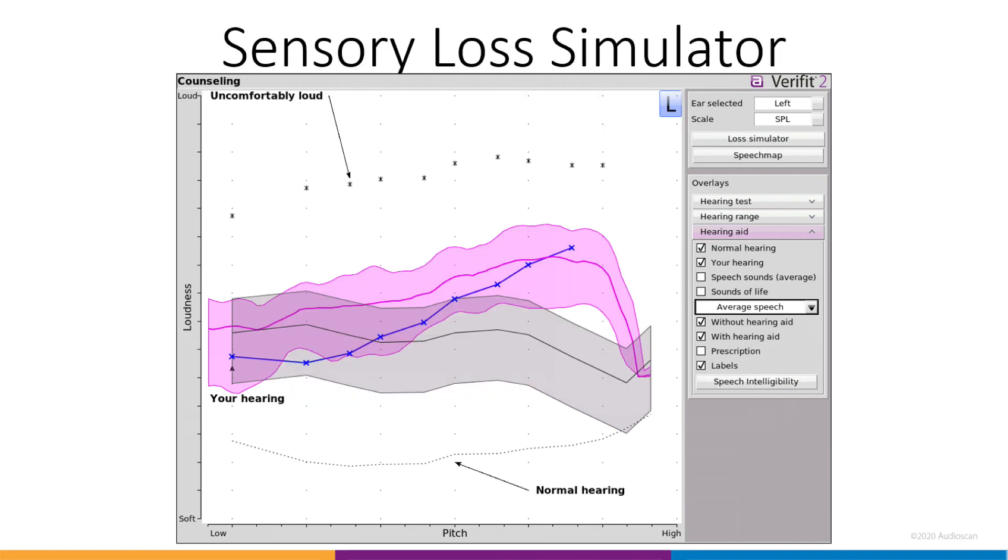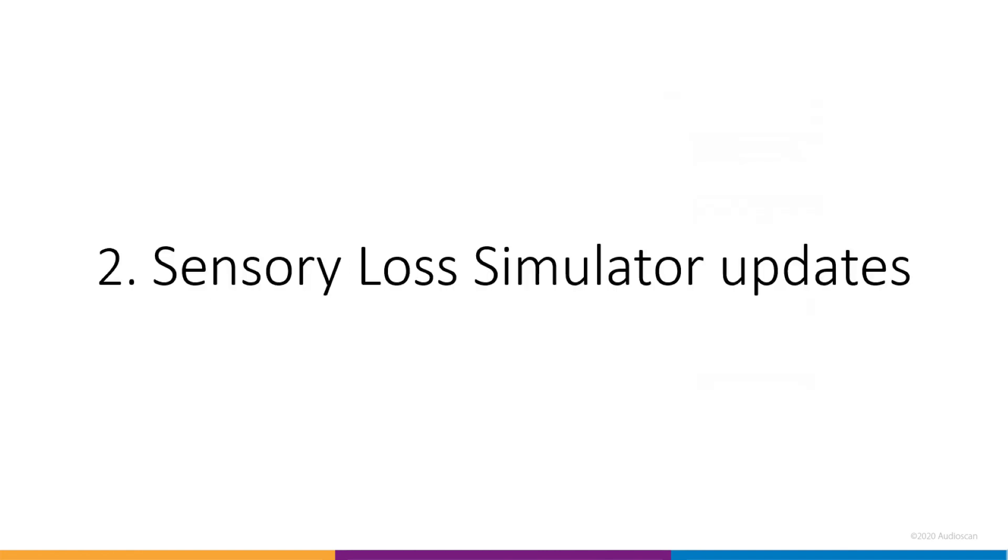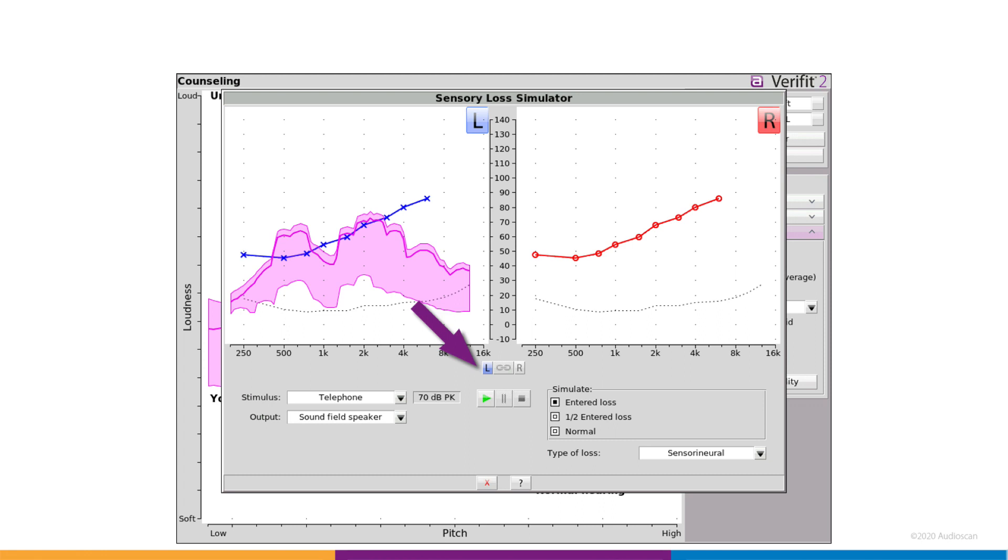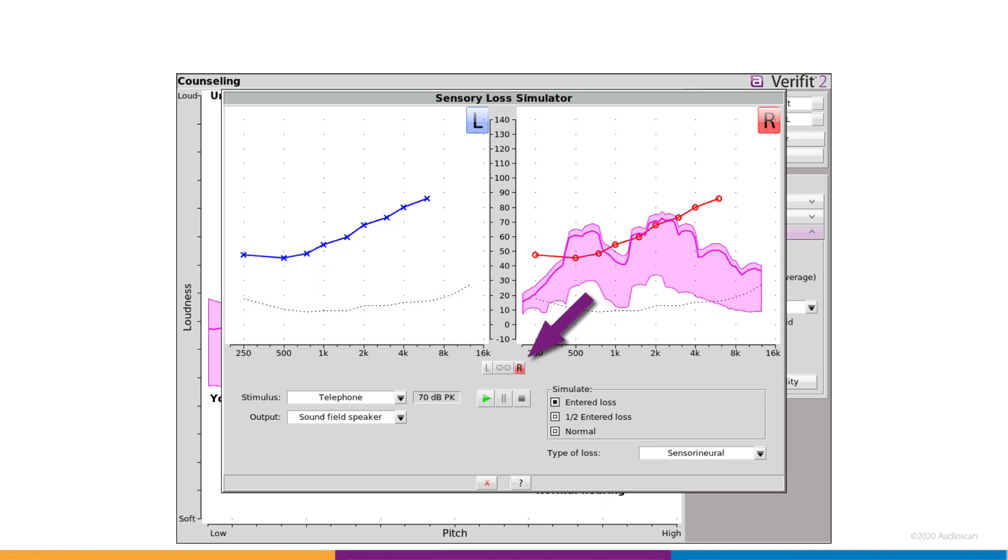Finally, in the upper right-hand corner, we have a button to launch the sensory loss simulator, which brings us to our next software feature. Updates to the Sensory Loss Simulator. AudioScan's familiar hearing loss simulator has had a few updates in this release. The interface has been refreshed and now presents in a binaural view.